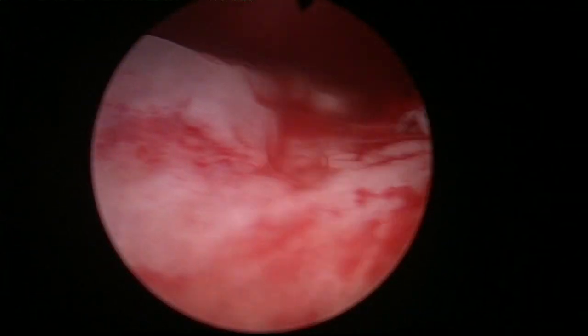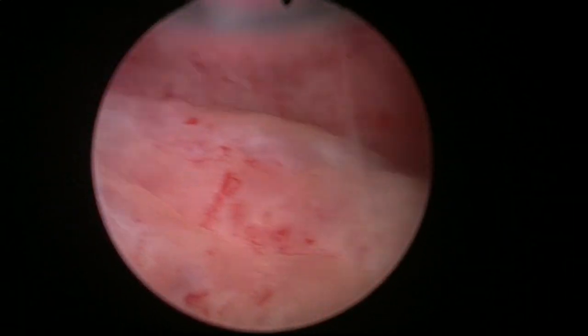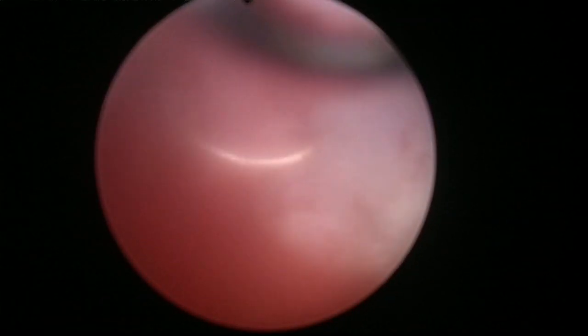So there we are. Let's have a look. Déjame el este. This is a monopolar resectoscope. We don't have a bipolar because we don't do TURP. That's an empty bladder. You see there's some oozing. Here's the orifice again. It's the fossa. Let's see if there's any piece inside. It doesn't look as if there is any piece. And then look at the sphincter.